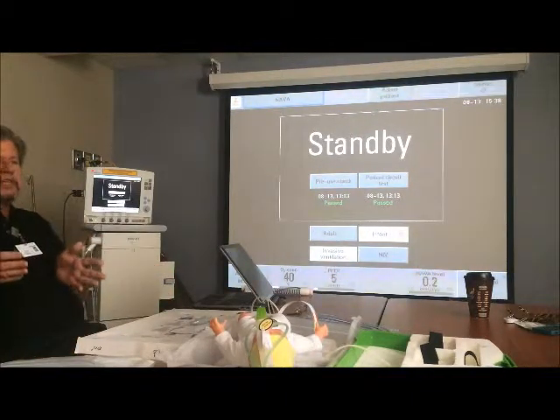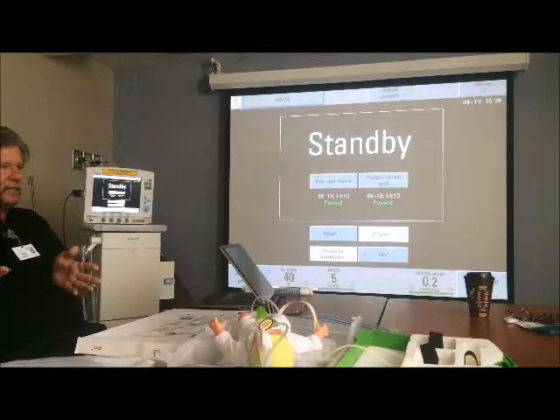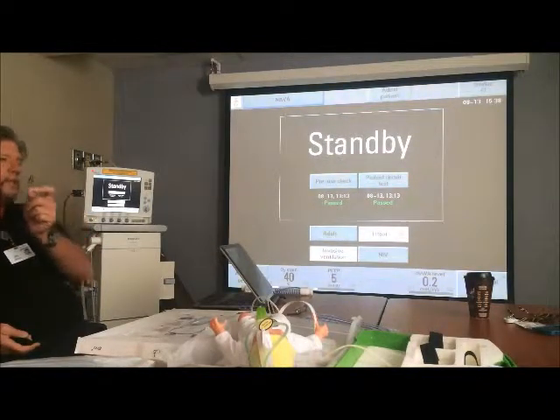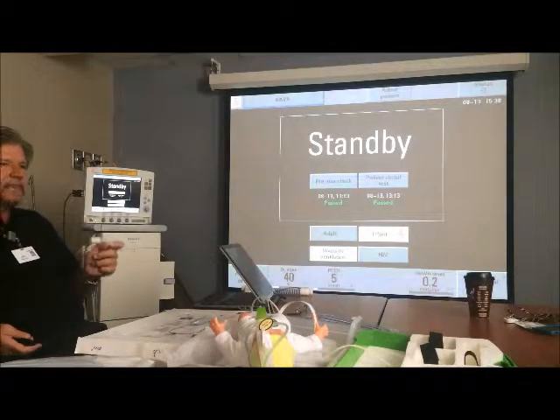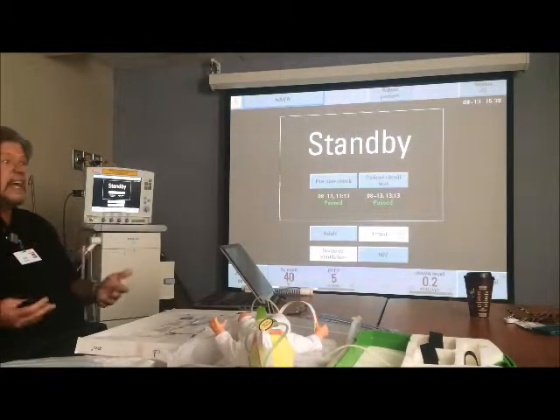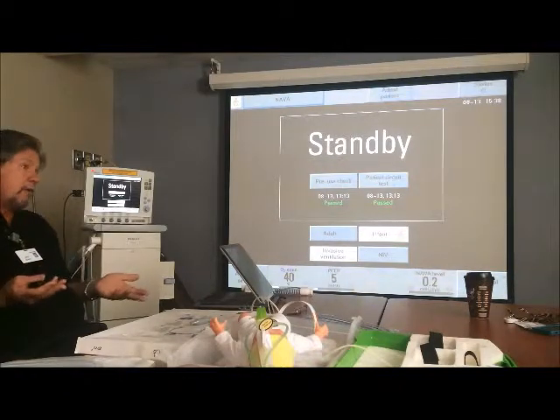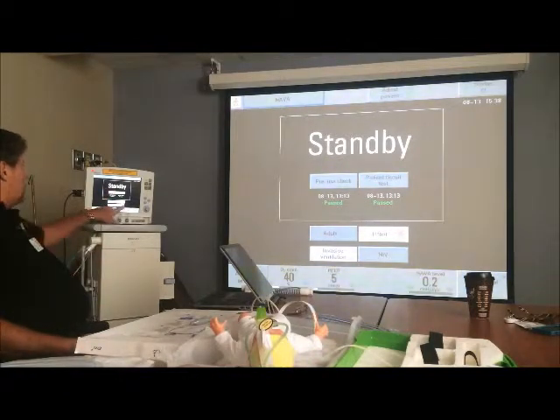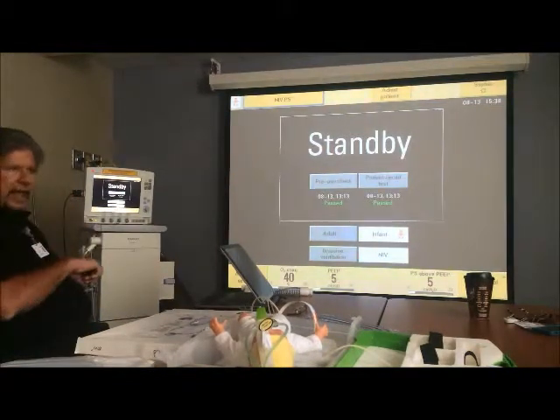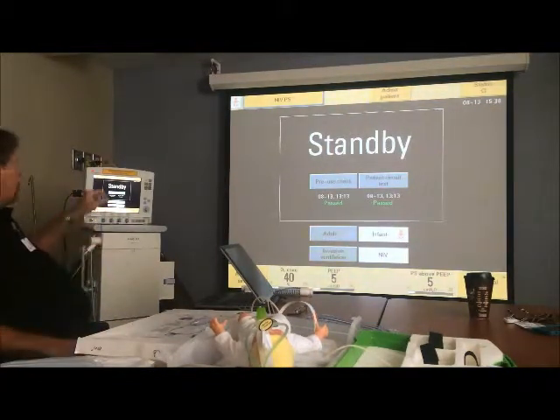But if he's on bubble CPAP, but he's just having the apneas, it's most likely that his EDI is going to be relatively normal, 10 to 15 microvolts, somewhere in that range. So 0.2 times 10 is only giving him 2 centimeters of pressure support, right? Which is negligible pressure support, right? So what we would do is we'd have him in non-invasive. We put the catheter in, let's say he's still on the bubble.